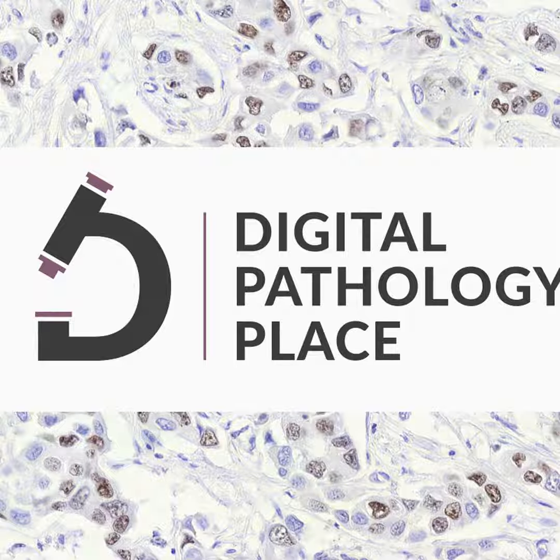So, now I will say, and I don't know if we're going to talk about this, a lot of the algorithms now are trained at 40x or even different magnification. So 20x is adequate for primary diagnosis, but the question is, will it be adequate for all the algorithms that get made? If they're trained on 40x, that's an open question. Yeah, then you probably would have to train at a certain magnification.